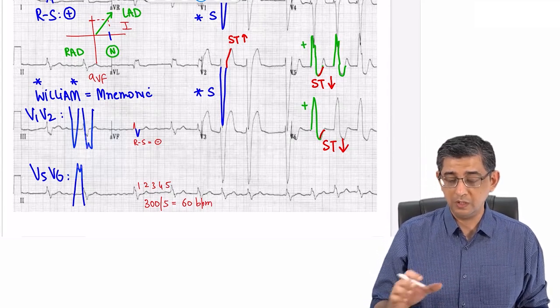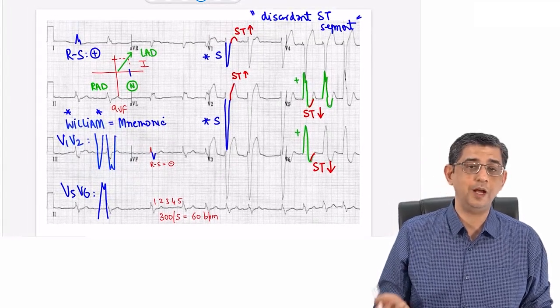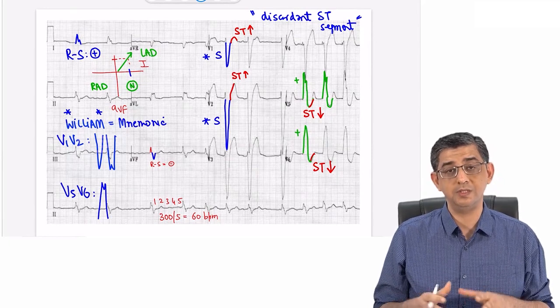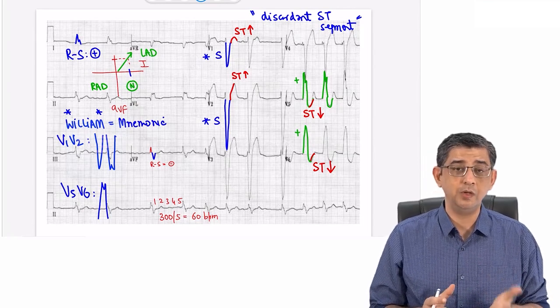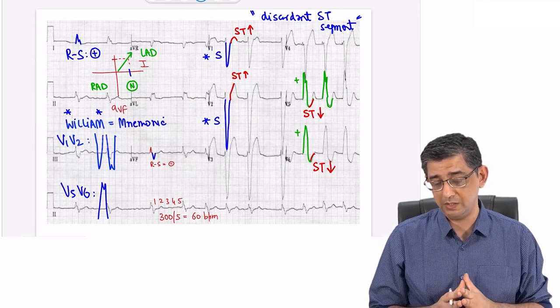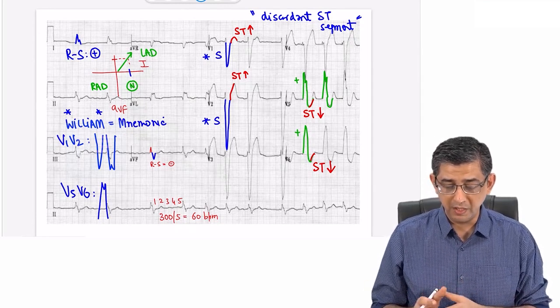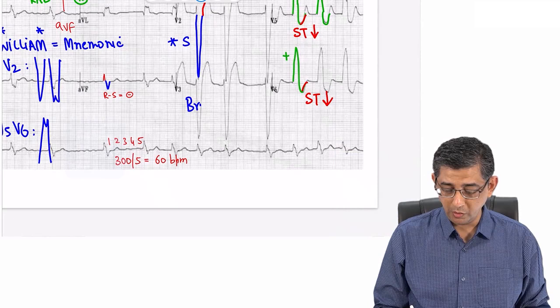The most important thing about identifying bundle branch block would be that don't go for absent Q waves, though I told you in the beginning, because that is how it is given in the textbook. Absent Q wave is something that is difficult to appreciate because Q itself is very small. So we will look at the gross changes which are present here, and over and above this, wherever you look, guys, you will always notice that the person is also having a broad QRS.